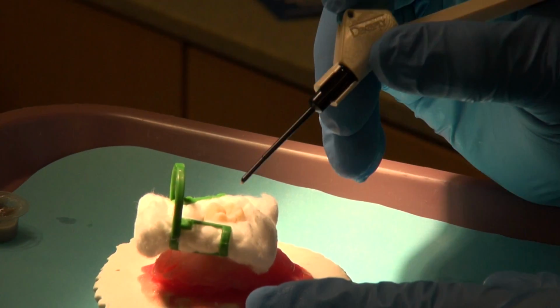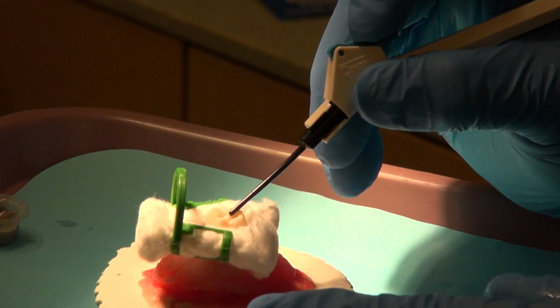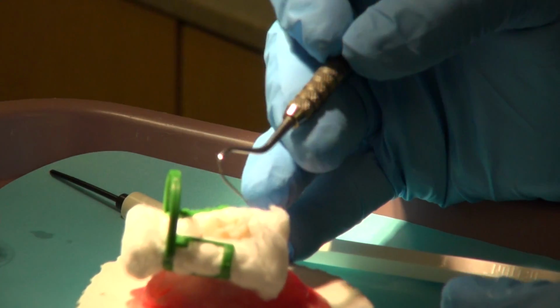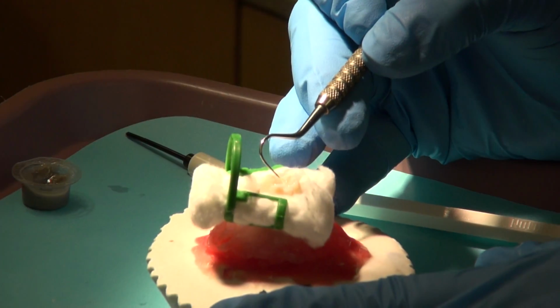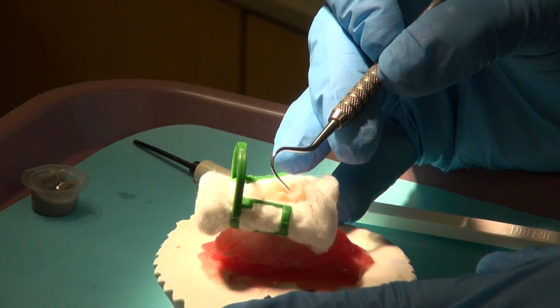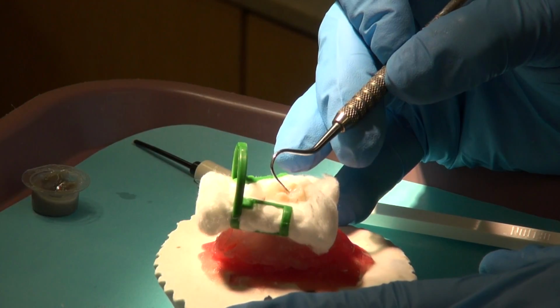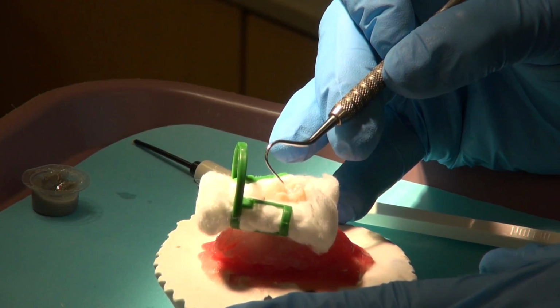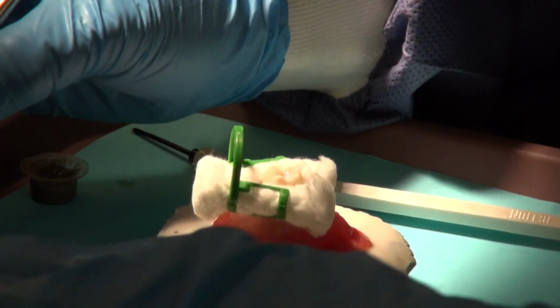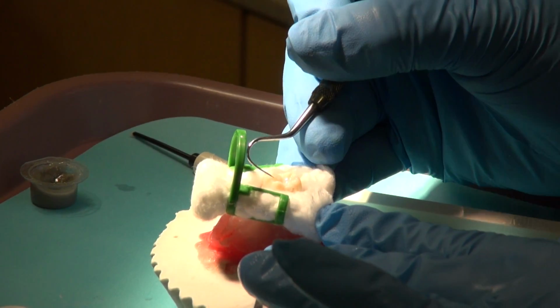Important that we just place a little dot right in the center. Just a little dot, and you can see that white blob. Take your Explorer pen grasp and drag it through the ridges. Again, you don't want height here. You want this sealant material to flow down into the grooves and into the ridges, all the way down inside. Have an instructor check before you light cure to seal, and we're good to go.